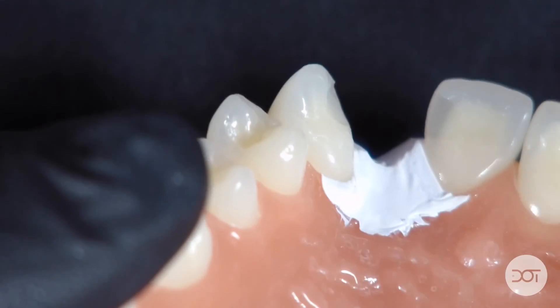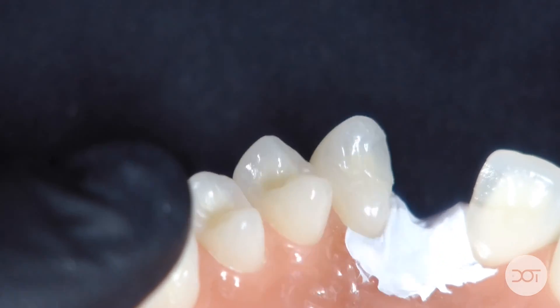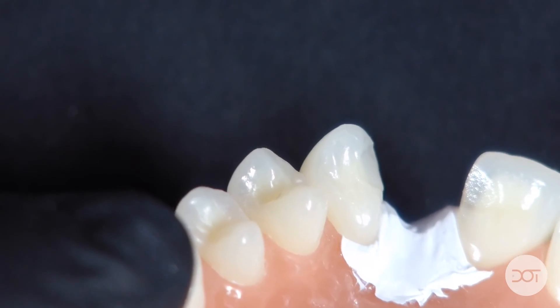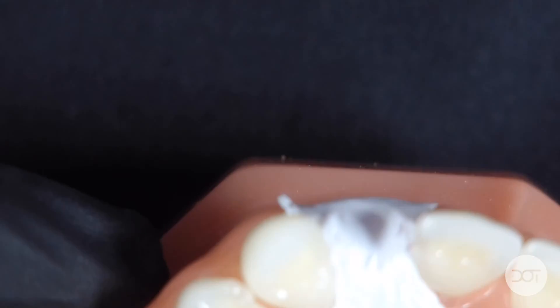We have our preparation already completed, and we've placed adhesive on the model — in the mouth, of course, we would etch the tooth and place our adhesive. You'll also notice that I'm using Teflon tape to support and protect the pontic surface area, as we do in our course on the direct resin bonded bridge. If you're not familiar with rib bond, it is a reinforced fiber material that is perfect for these types of bridges.